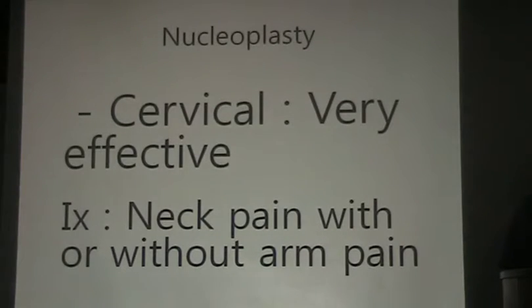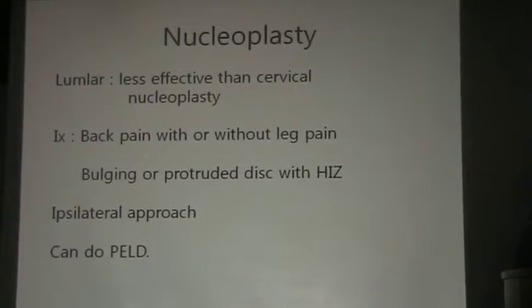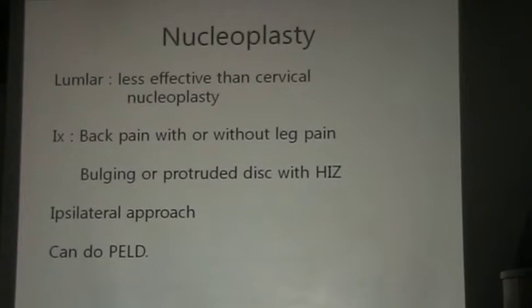Okay, next topic is nucleoplasty. Nucleoplasty in the cervical area is very effective compared to the lumbar area. The indication of nucleoplasty is neck pain with or without arm pain. Lumbar nucleoplasty is less effective than cervical nucleoplasty, but it is good. The indication is back pain with or without leg pain, and a bulging or protruded disc with HIZ. And I use an ipsilateral approach.